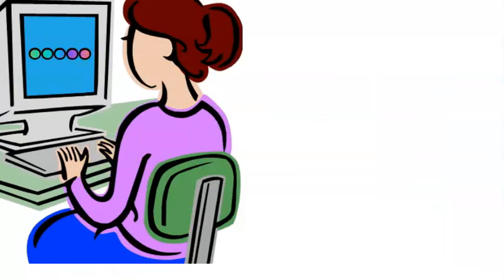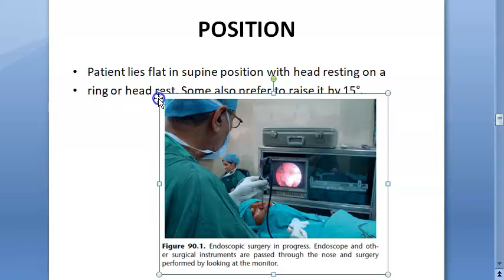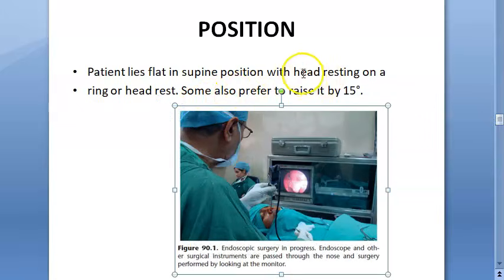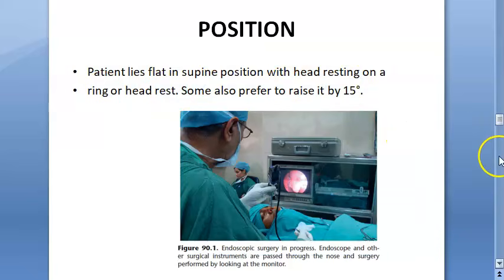Local anesthesia with IV sedation. So it is general or local. Then position, supine position is enough. Headrest on some ring or headrest, but some people prefer to raise the head by 15 degrees.